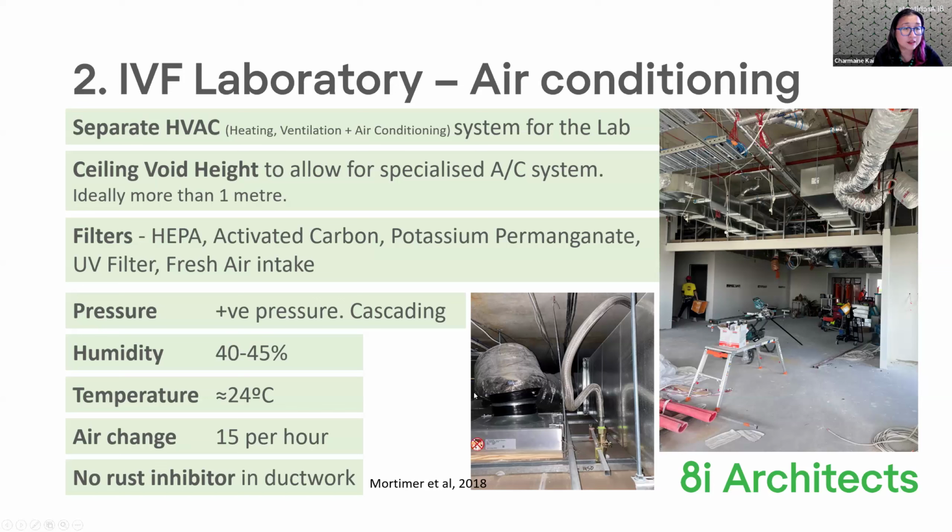So ideally in the air conditioning system, you do have a HEPA filter, and most labs now moving forward will try to have a HEPA filter. That removes particulates. So ideally for an IVF lab, you want to add things like activated carbon to reduce the VOC that does build up within labs over time, potassium permanganate, a UV filter to kill off microbes as well. And then think about fresh air intake.